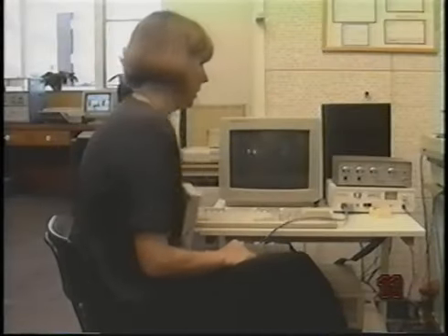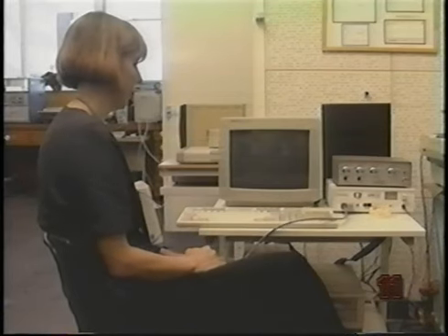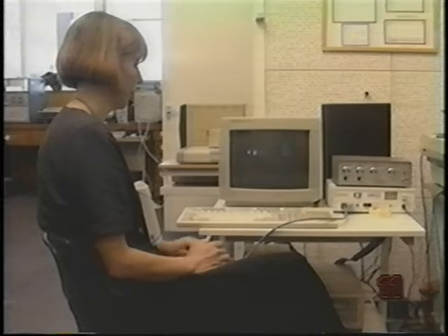We will now demonstrate the contact patterns of some English sounds. EPG is particularly useful for showing place of articulation for alveolar and velar plosives. First, alveolar plosives. Ta. Ta. During the closure phase of the plosive, note the full contact at the alveolar ridge and along both sides.